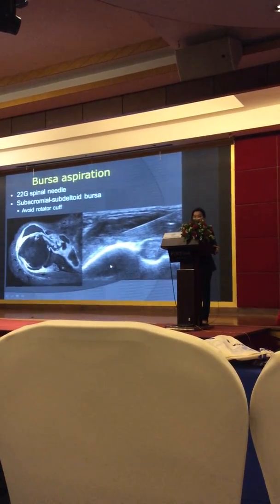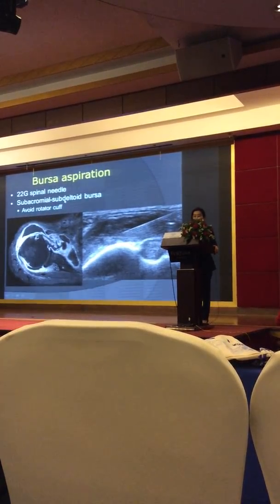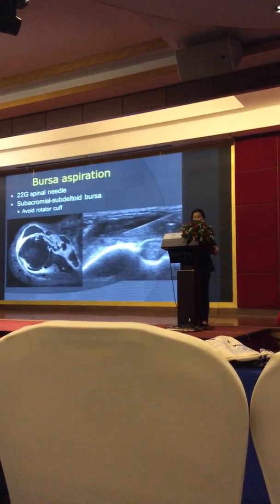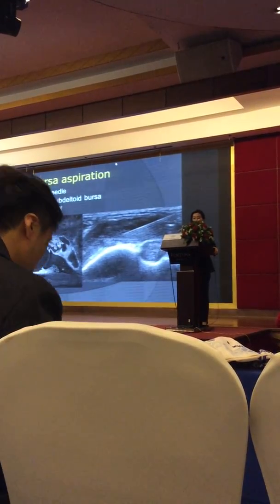For bursal aspirations or injections, usually use 22 gauge spinal needles and target the subacromial-subdeltoid bursa. Please try to avoid the rotator cuff to avoid injury.